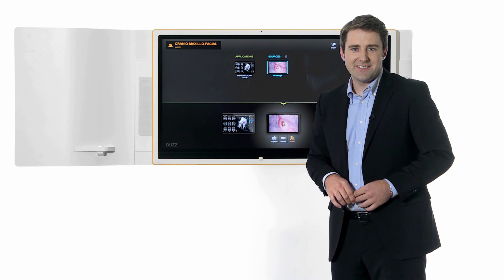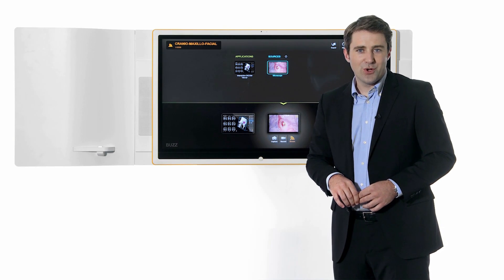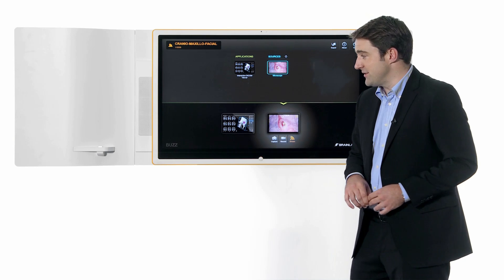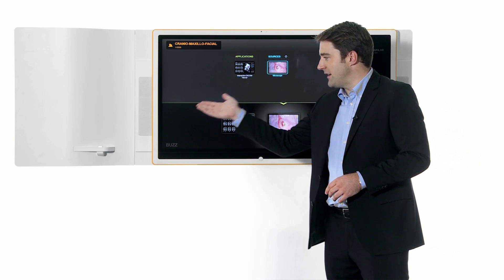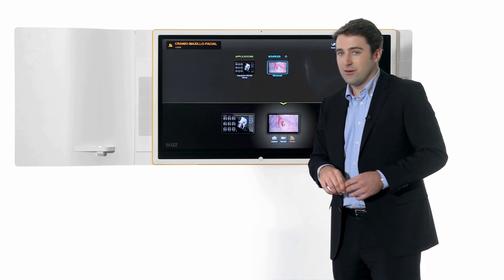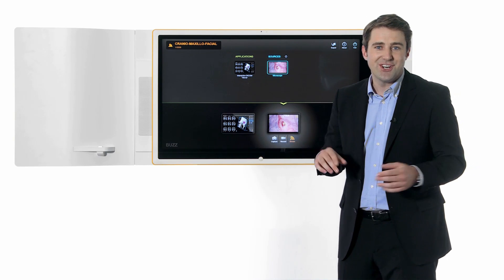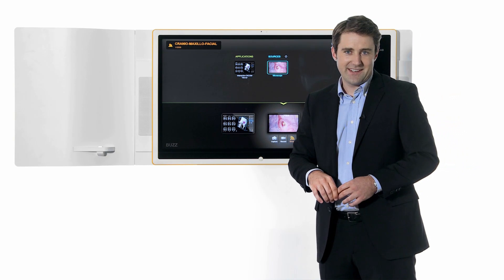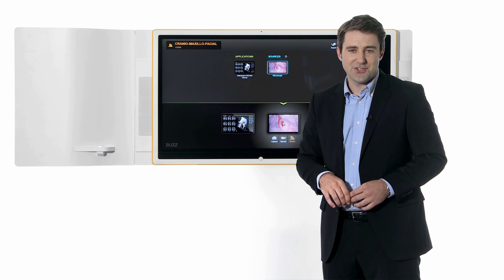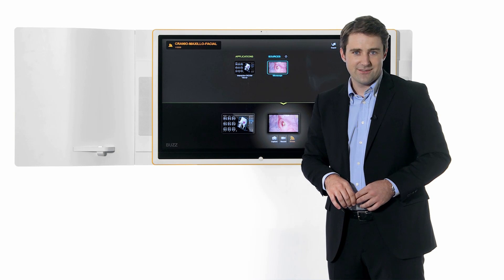Buzz is available as a mounted, on-wall setup with built-in sound system and iPod dock, or as a larger, in-wall setup with two touchscreen displays.